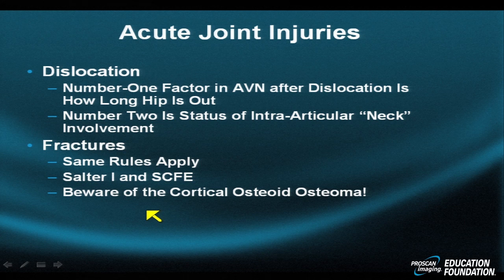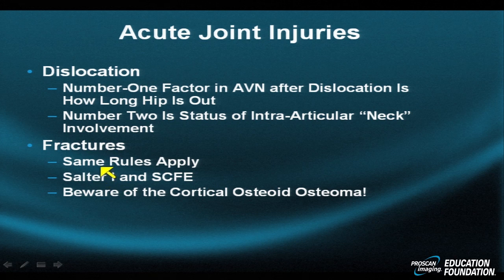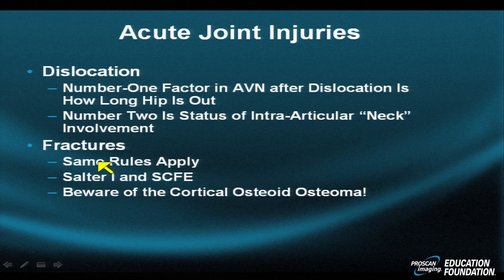Two other caveats: don't forget to look at the physis. Physeal fractures are commonly missed on MRI. They present as areas of physeal widening in the setting of acute trauma. You can also get physeal widening due to indirect or repetitive low-grade trauma, but that is a story for another day. The history will be very helpful to you — namely, the history of an acute event.